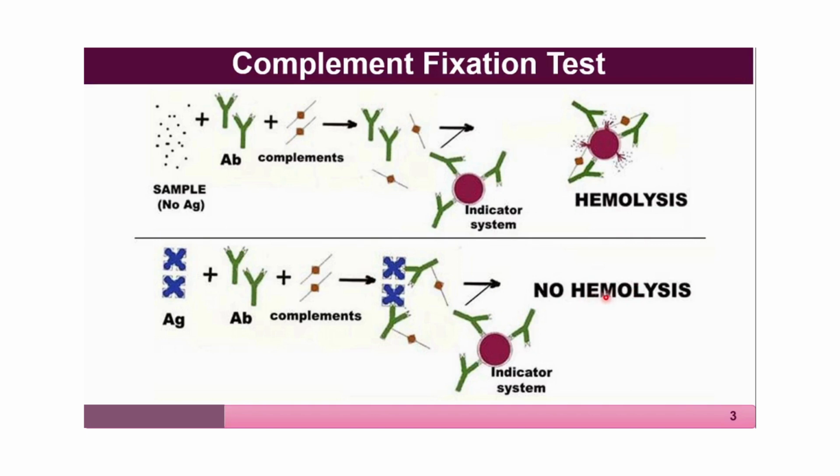Here, the complement is not available now to cause the hemolysis of the indicator, because it is readily engaged by the antigen-antibody complex.